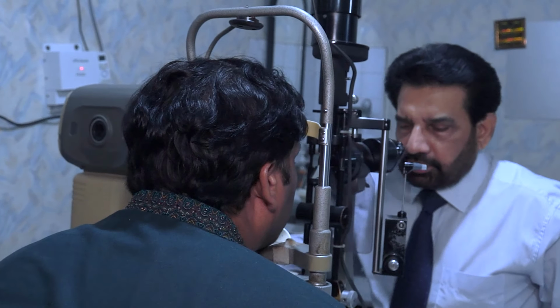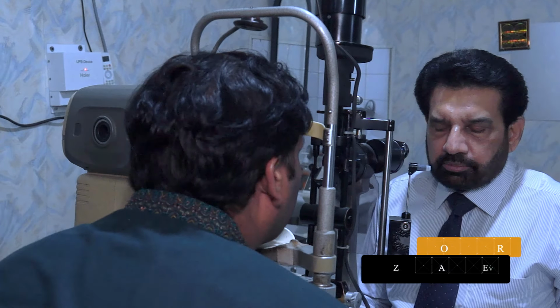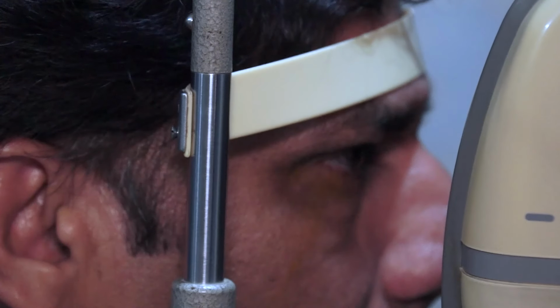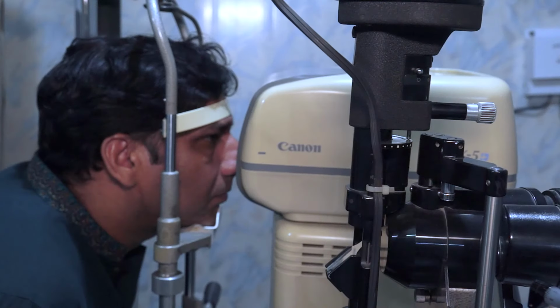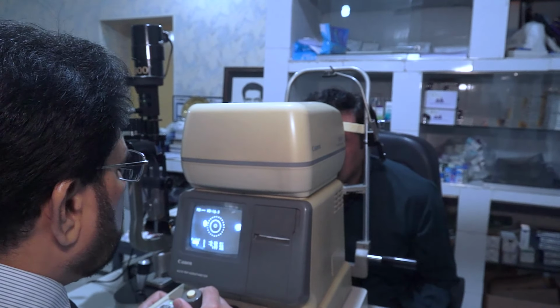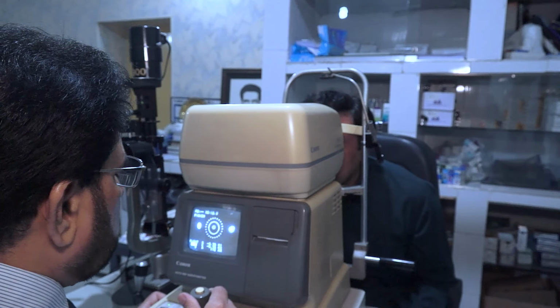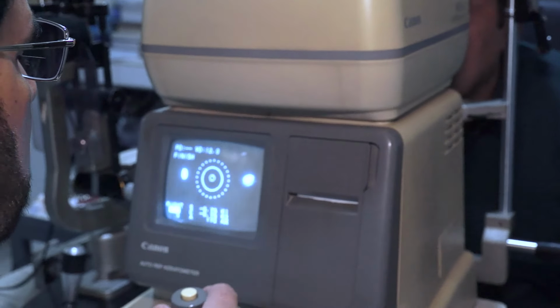Now we are going to examine the patient's refractive error with an auto refractometer. This is an auto refractometer, and we are going to refract the patient. You should see the patient's one eye first, the right, and then the left. The patient is going to see a target in the camera of the machine. Now you have to put it either on the automatic mode or on the manual mode. This is on automatic mode, and so this will automatically take the refraction of that eye. Now this is the right.